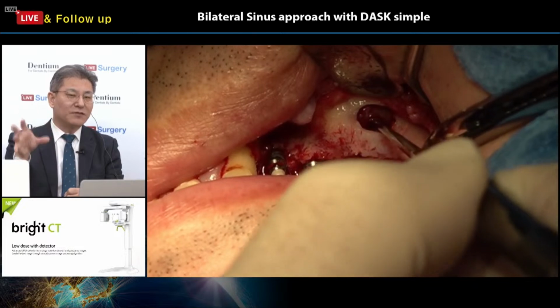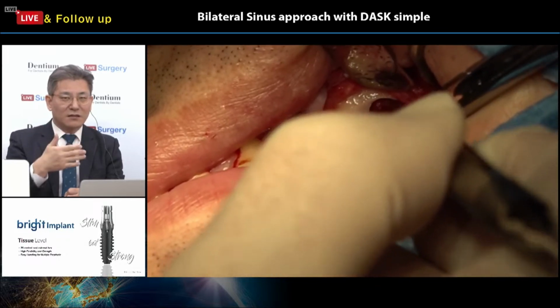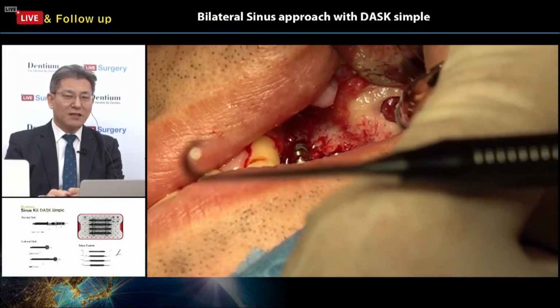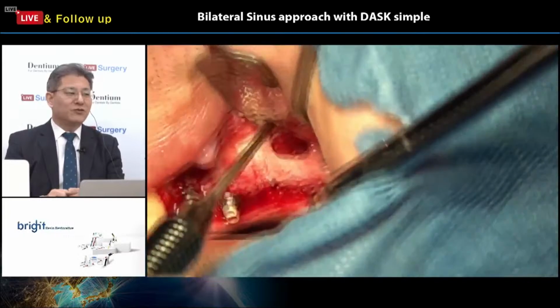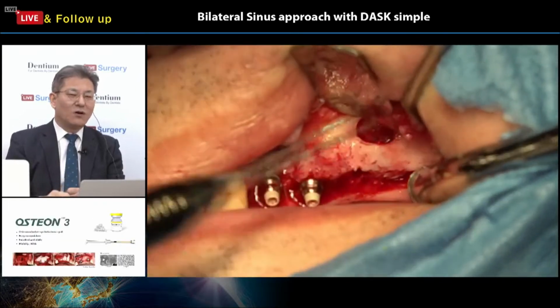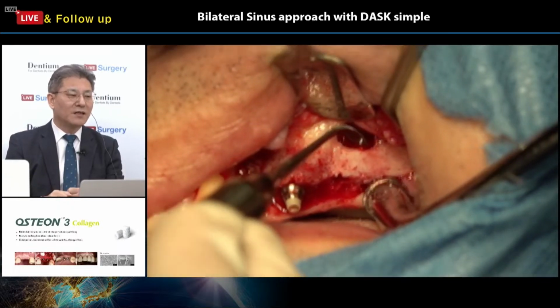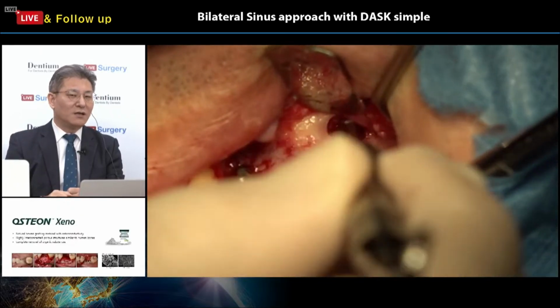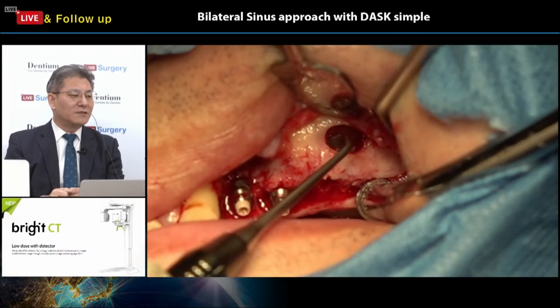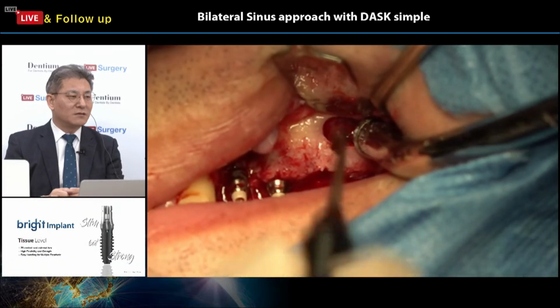First, as you know, the elephant foot is first, and next, the different angled sinus curette will be applied, and finally, the long ball instrument should be applied to separate until the medial wall of the sinus, right? For the full detachment of the sinus membrane until the medial wall, you have to use a long ball instrument like this here.